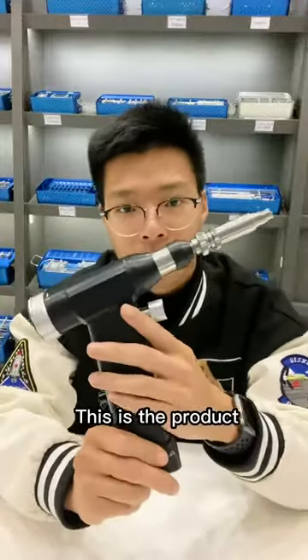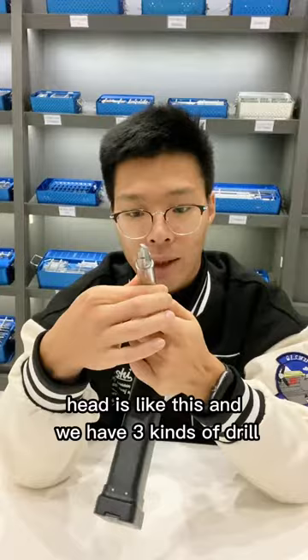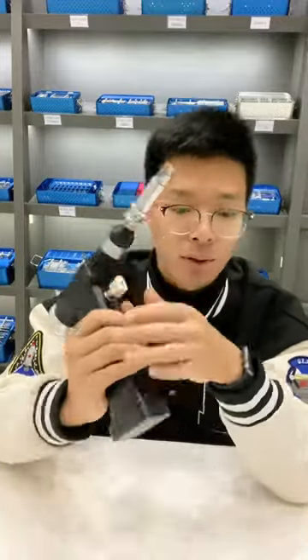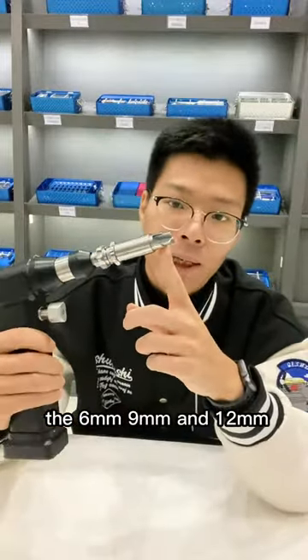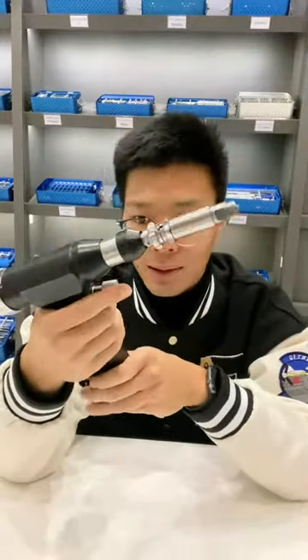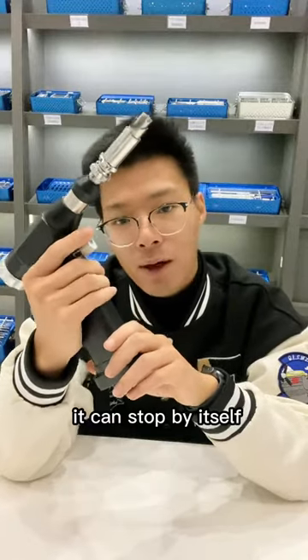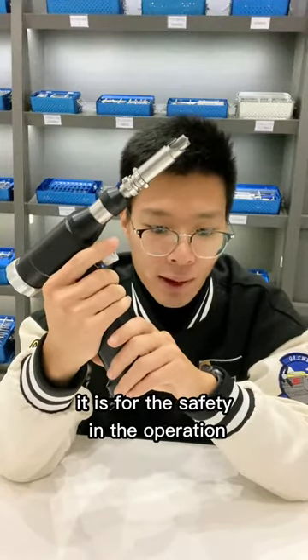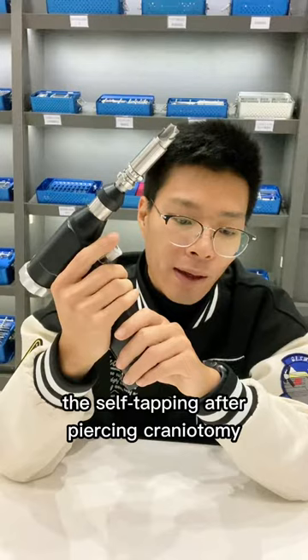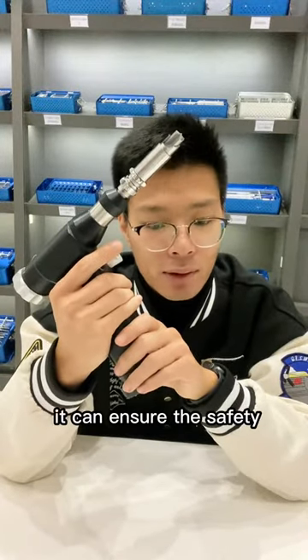This is the product and you can see the head is like this. We have three kinds of drill: the 6mm, 9mm, and 12mm. The advantage of this power tool is that it can stop by itself. It is for safety in the operation — the self-stopping after pressing the Cranium Tommy drill can ensure safety.